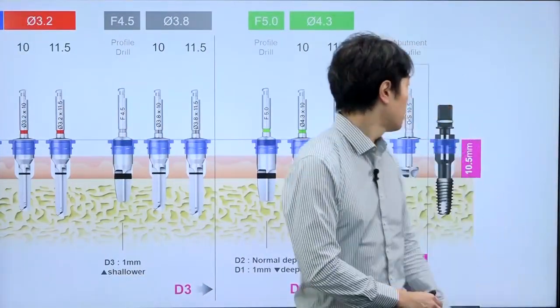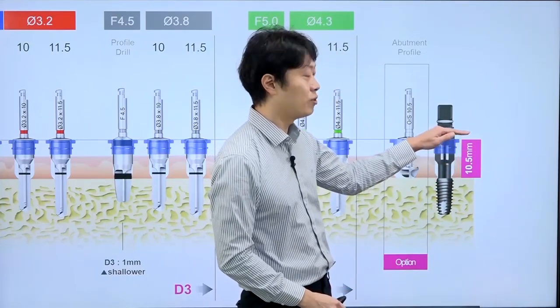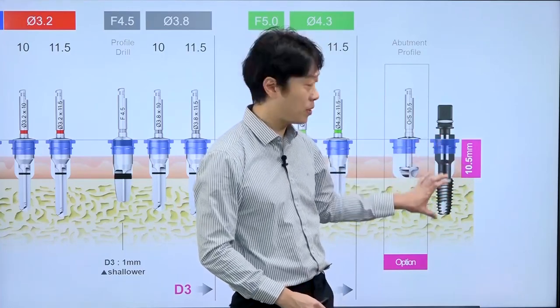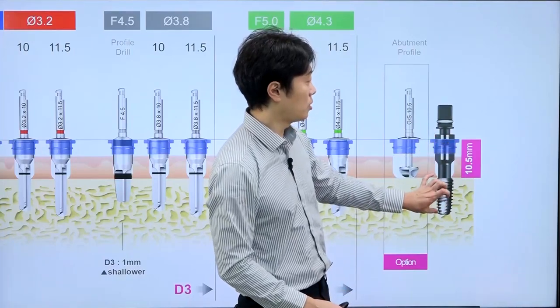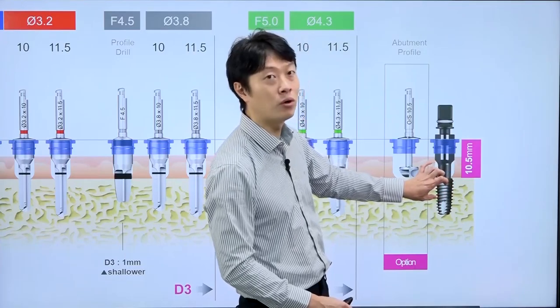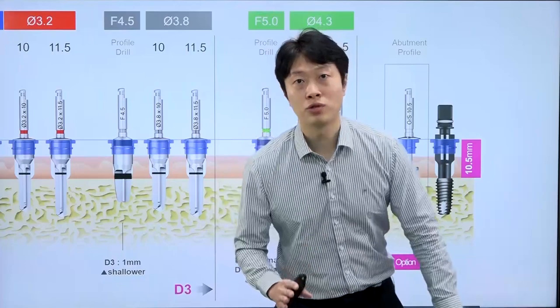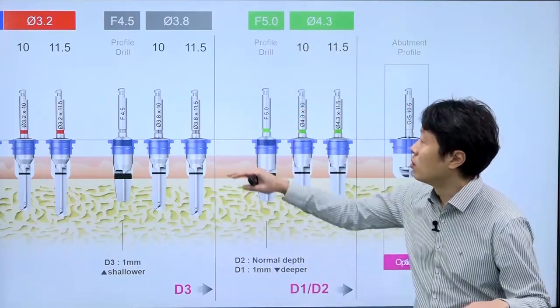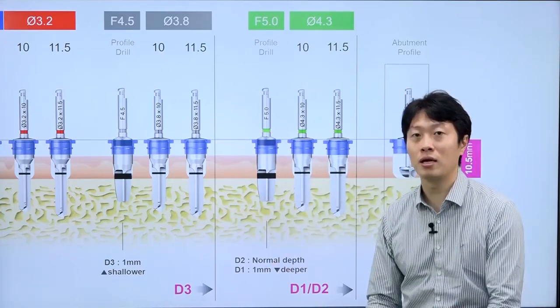And in the final implant placement as well, you should place the implant one space above the lowest baseline of the implant connector to position the implant with the accurate depth. If it is set 1.5 mm shorter, the implant may be placed 1.5 mm shorter from the target position since the offset is 10.5 mm. So when the offset is 10.5 mm or 12 mm instead of 9 mm, you should thoroughly check the depth and length of drilling.